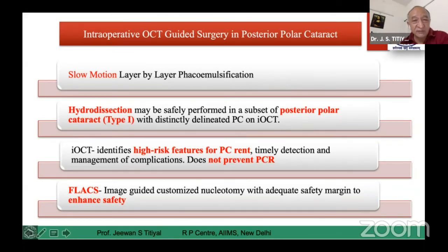Subsequently, you can remove the entire epicortical cushion en bloc. To summarize: with posterior polar cataract, the chances of rupture are now quite less with understanding of morphology and dynamics. Use slow-motion phaco with whatever machine you are used to. Hydrodissection: yes, for a clearly delineated posterior capsule; avoid in Type 2, Type 3, and Type 4 where the capsule is already open. OCT may help you decide the next step. iOCT per se may not prevent the incidence of PCR in Type 3 and Type 4 cases, but it is a good tool in difficult situations like posterior polar cataract. Thank you.